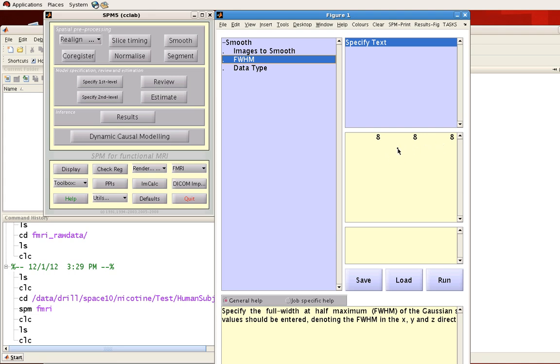In other words, we can change the amount of smoothing we want in one direction without changing the amount of smoothing in the other direction. But usually we select the same amount in all three coordinates. I'm going to leave that as is.